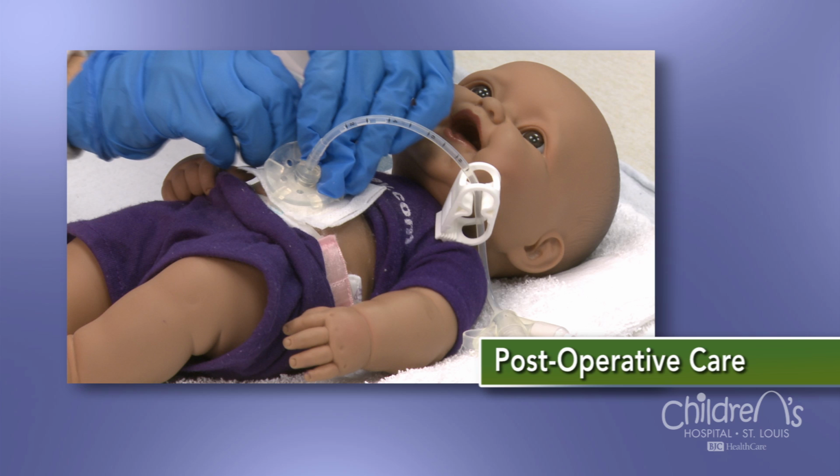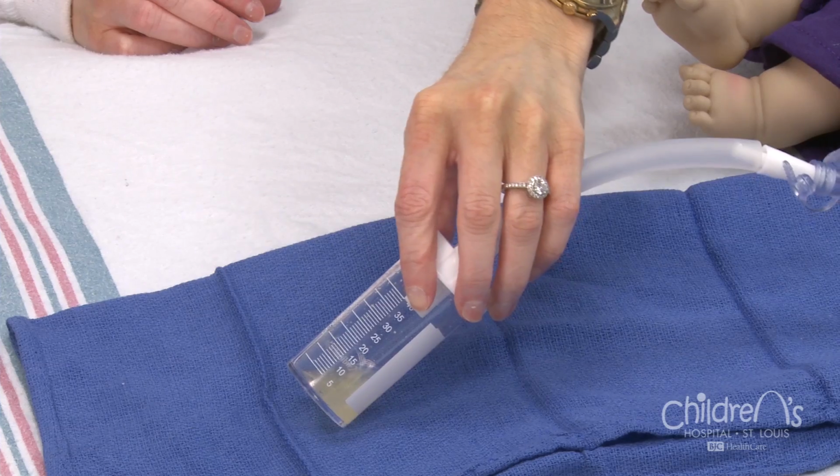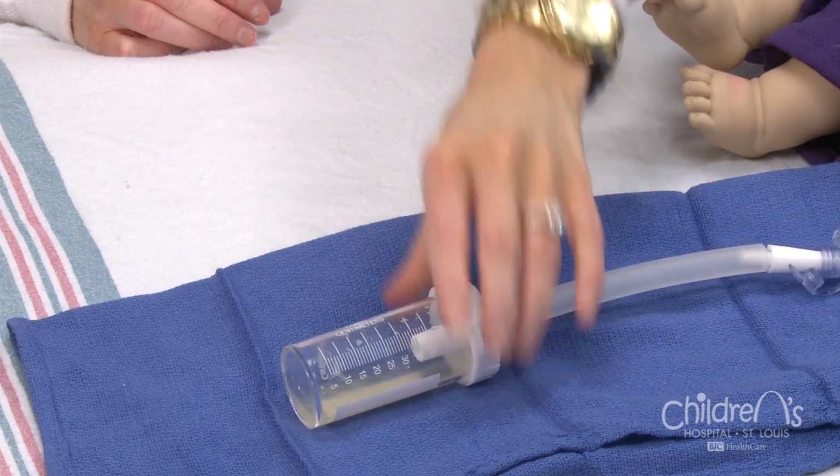Following surgery to insert the button, your child will need rest, pain management, IV fluids, and sometimes IV antibiotics. Your child will come out of the operation and may still be a little sleepy from anesthesia. This is normal. For the first 24 hours after surgery, your child's button may be connected to a small plastic container. This allows any stomach contents to drain out.